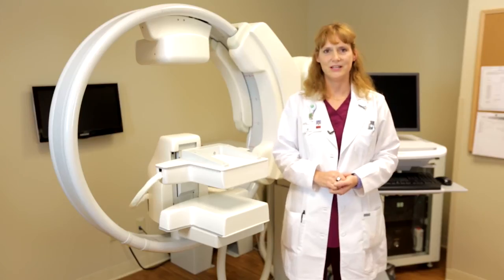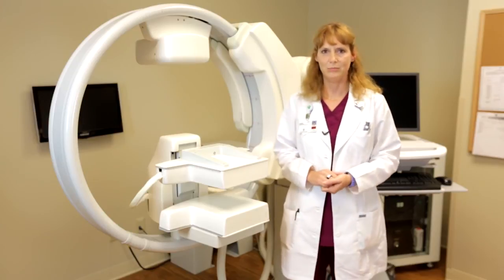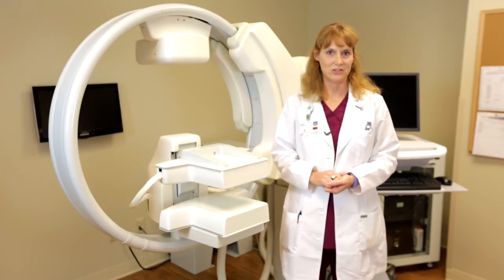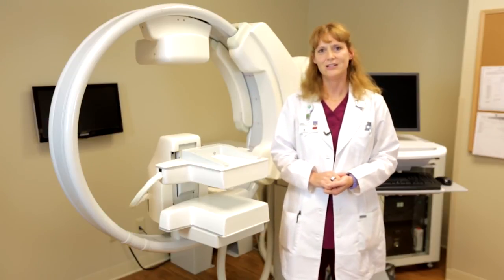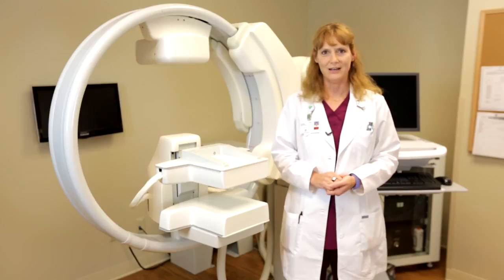One of the most rewarding aspects of my job is working with the patient. It's great that we're able to provide them with this technology to get them the additional screening they may need. It's also great that they're able to sit down with the radiologist and get the results the same day. That allows us to provide a higher quality of care, and that's very important to me.